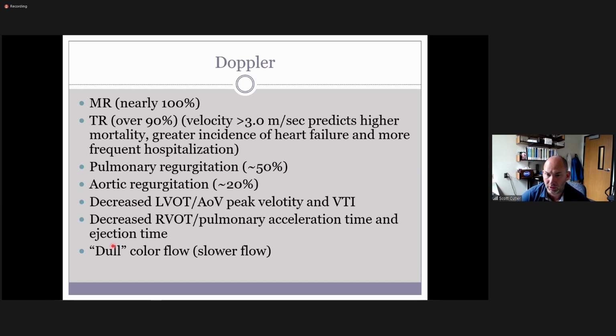So all the measurements relative to that. I don't necessarily need to spend a lot of time on the size of the pulmonary insufficiency or looking for pulmonary stenosis and doing acceleration times and things like that aren't going to be as relevant. If that's needed for something else, I can always come back and do that later if they want to.